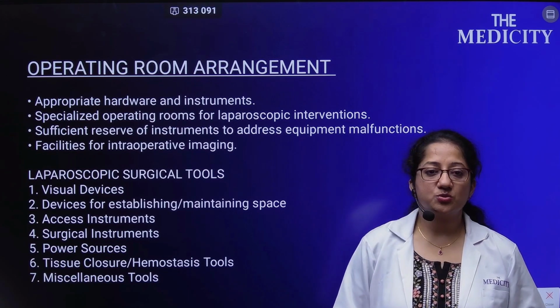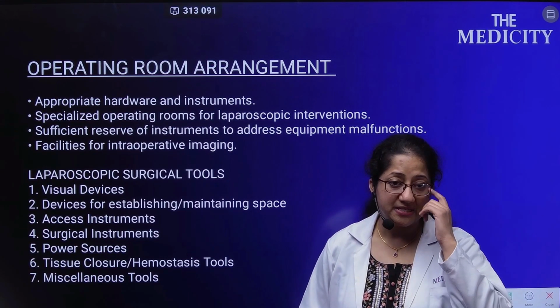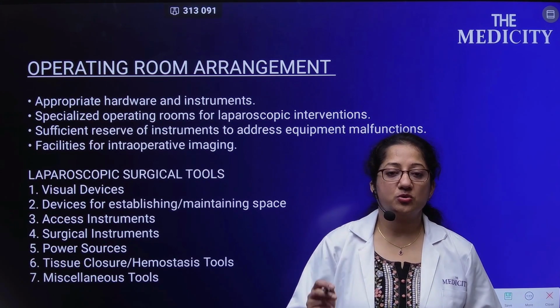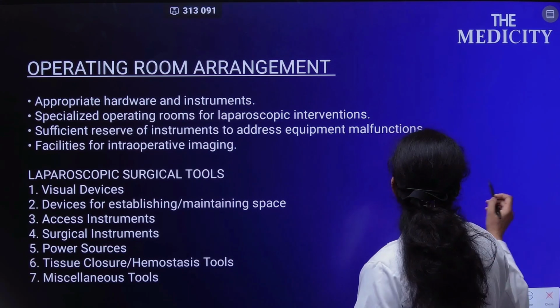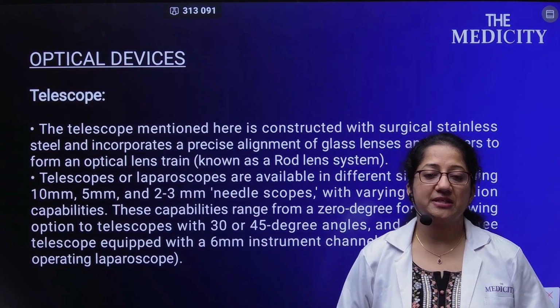Laparoscopic surgical tools are visual devices, devices for establishing or maintaining space, access instruments, surgical instruments, power instruments, that is cautery, tissue closure and hemostatic tools which help us to suture the tissues, and miscellaneous tools. Now, optical devices include the telescope.